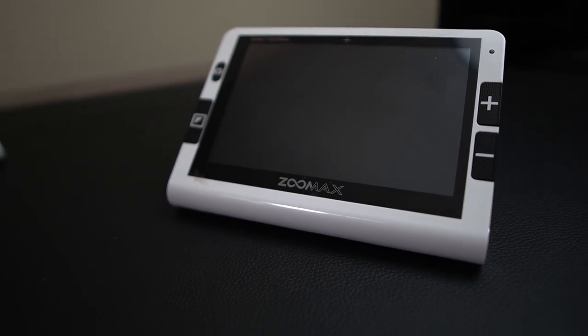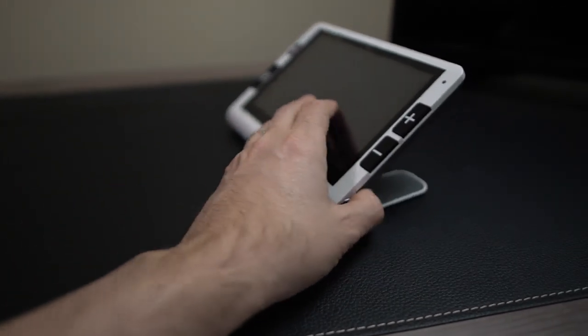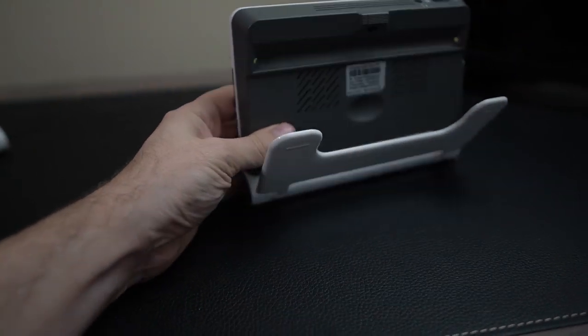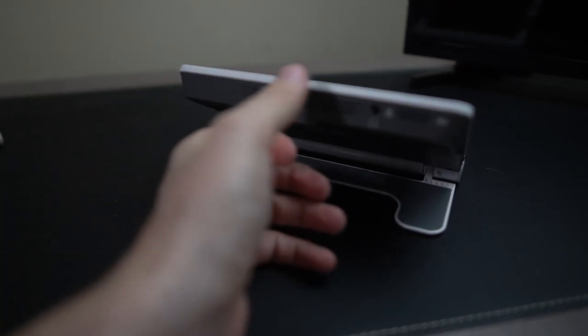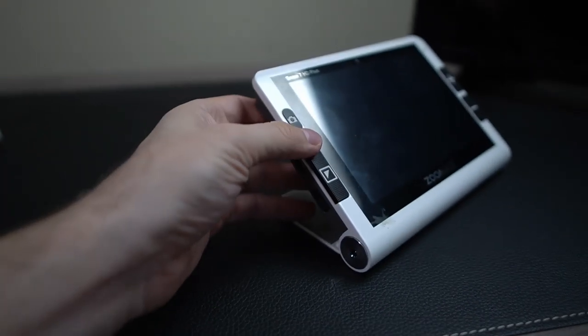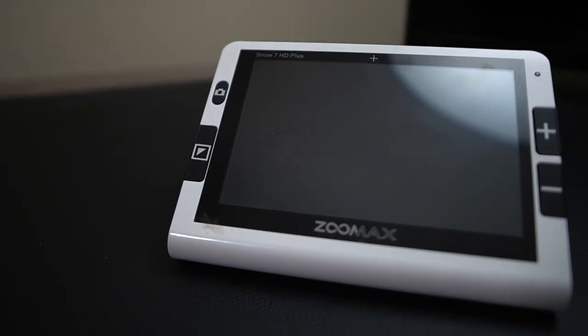The 7-inch is exactly the same as the 5-inch, just a larger screen. You've got your colors, your zooming in and out, and the full HD camera. The stand puts it at a nice 45-degree viewing angle. You also have distance viewing with this — with a slightly larger 7-inch screen you're going to be able to see it a little bit better. And once again there's a video out port, so you can display this on a large screen TV as well.